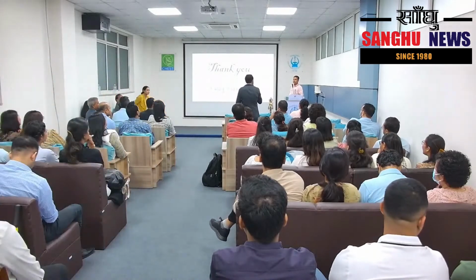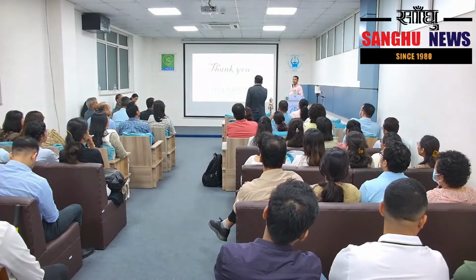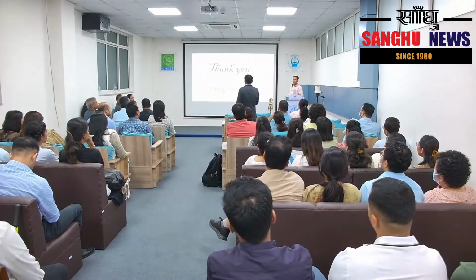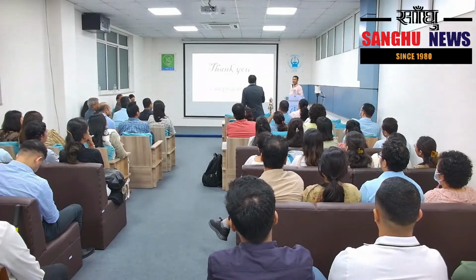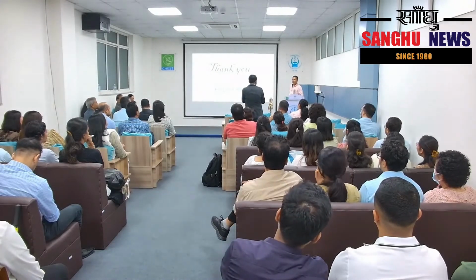Probably you don't know me, sir. I am Dr. Needas Parazuli. I work at Beer Hospital, but we are connected through cases. Two of your cases, I saw. I'm lucky enough to see it the first time, unlucky enough not to make a proper diagnosis. Okay, first, I'll go with the last case, where you don't have the clinical picture.